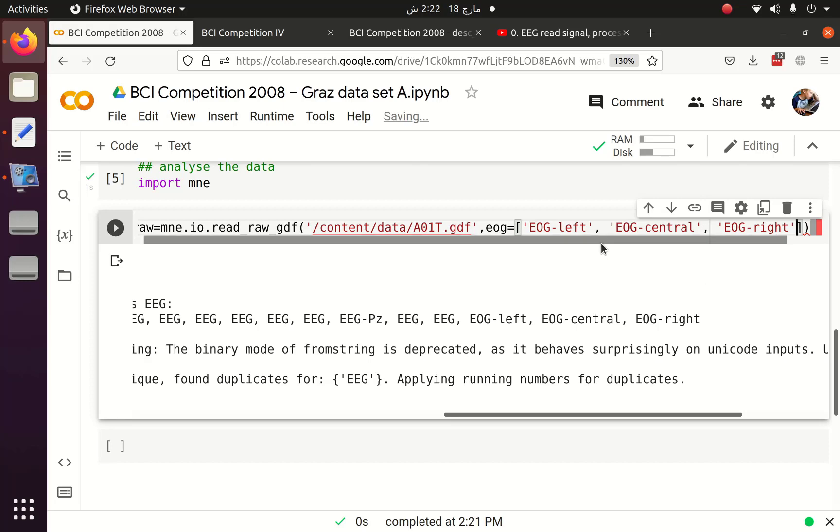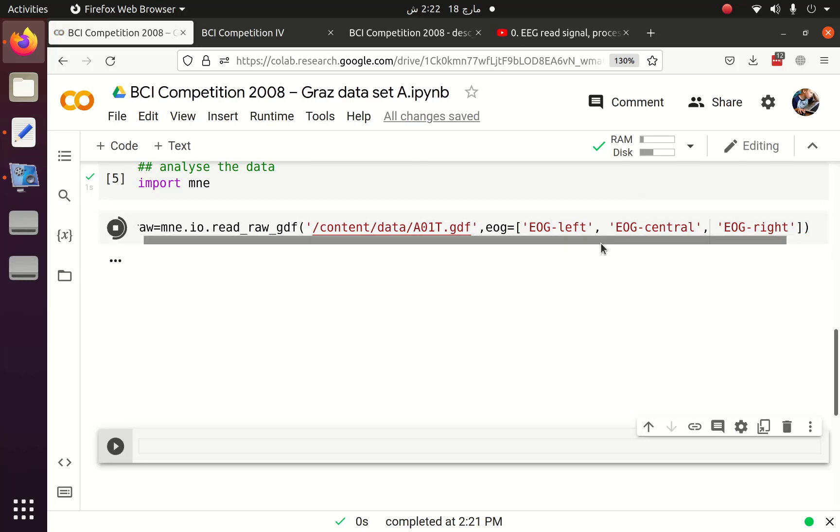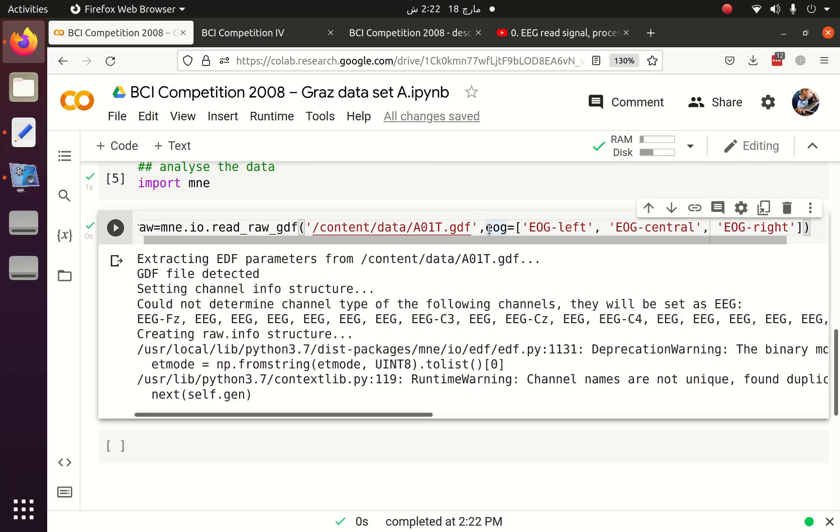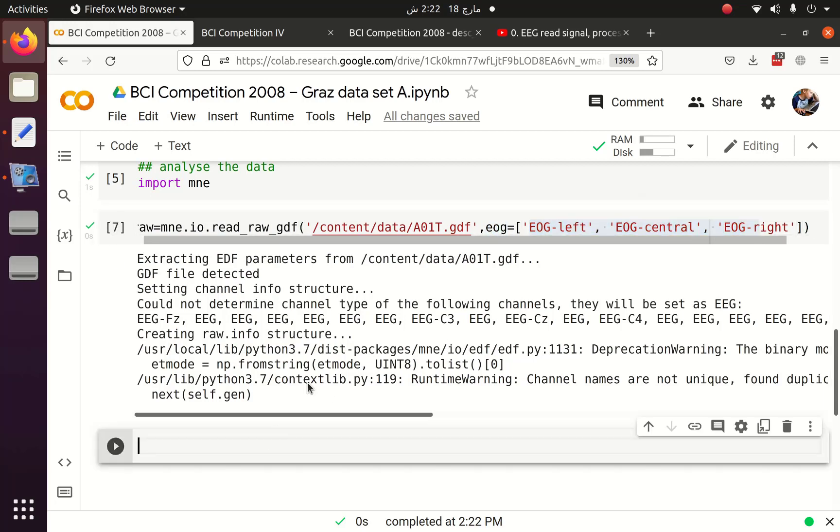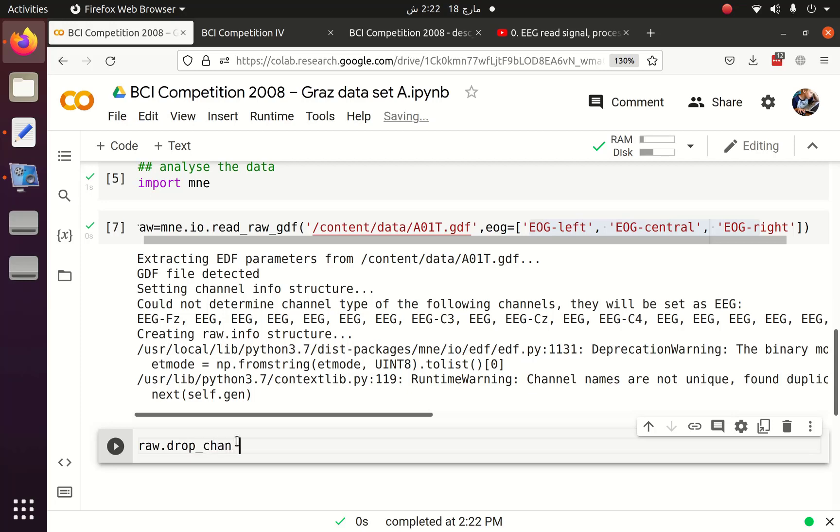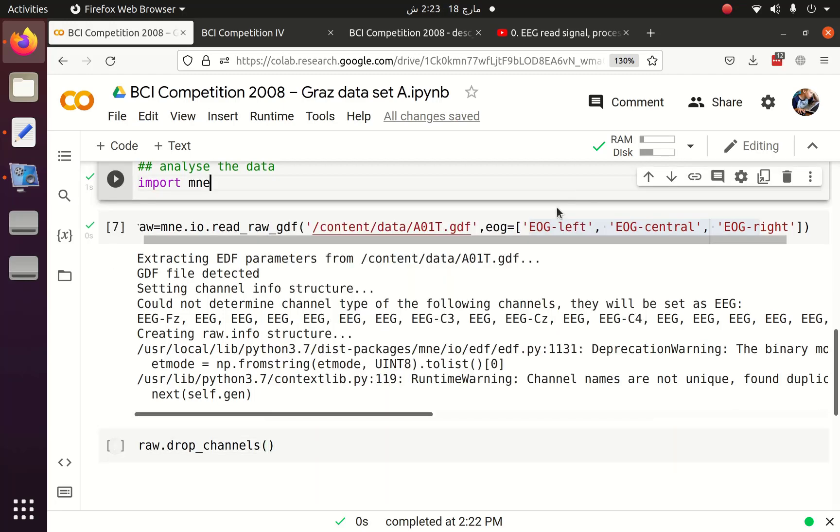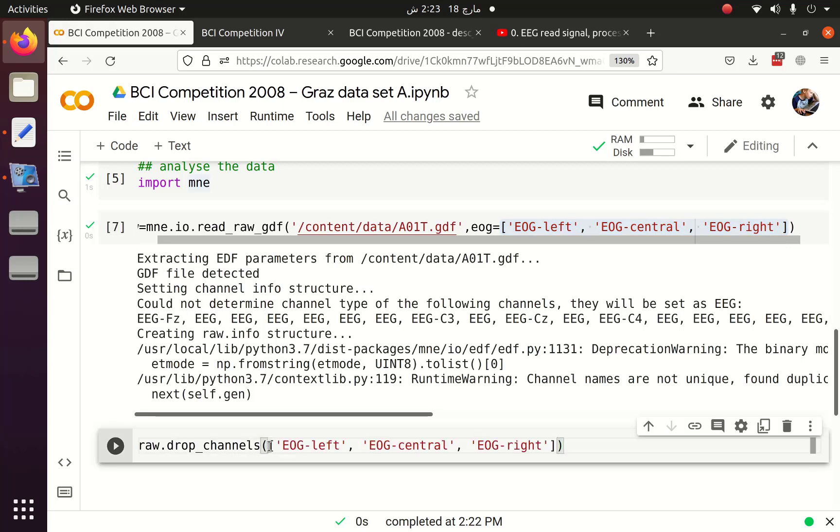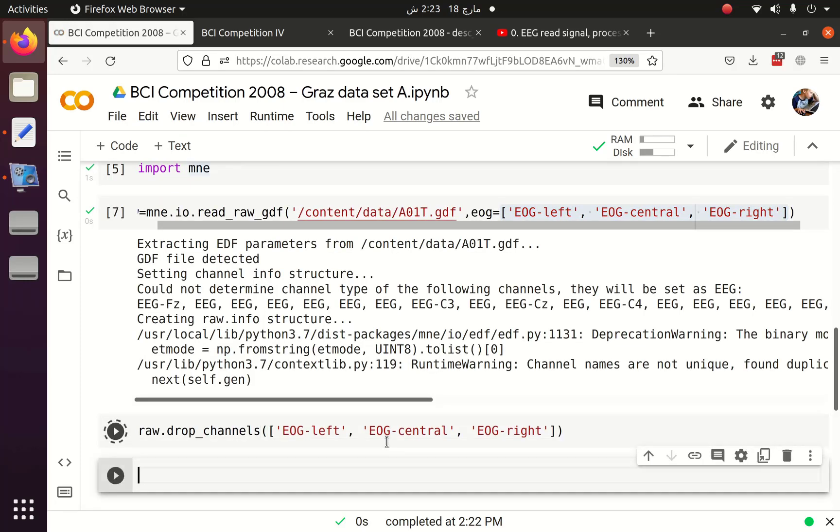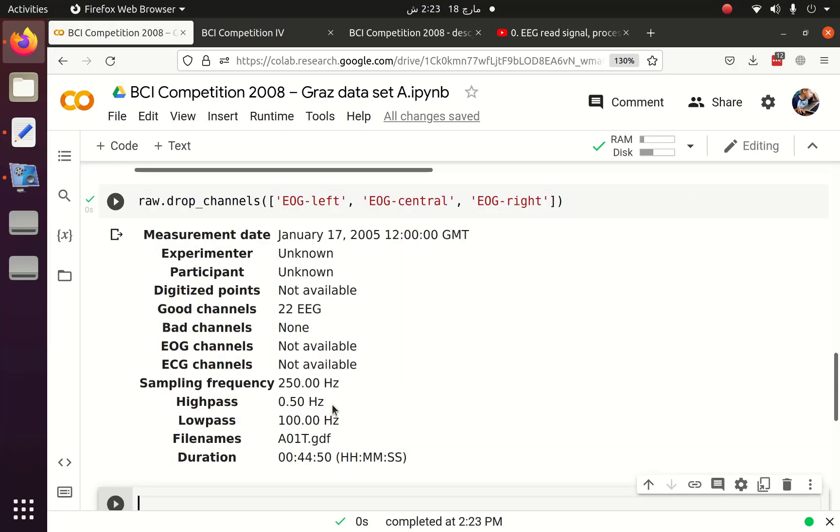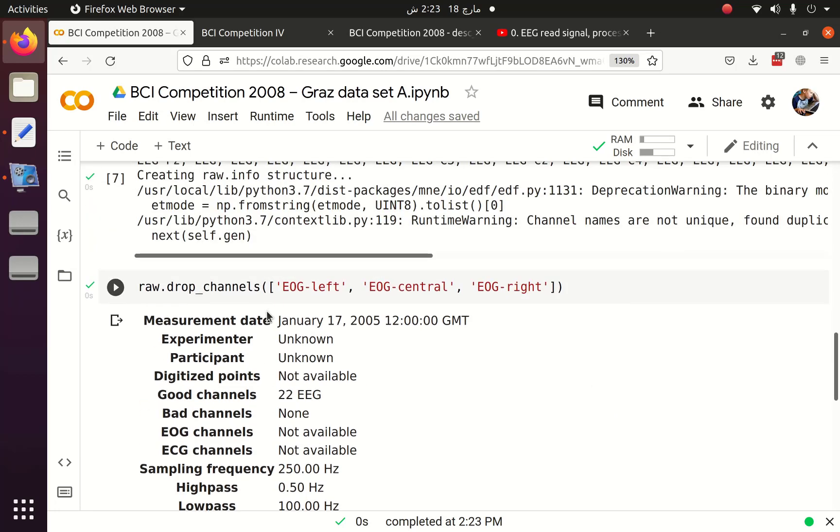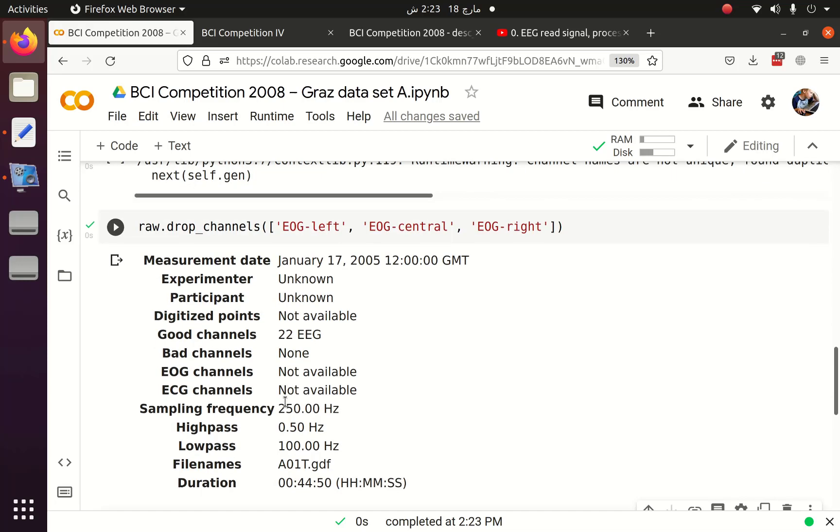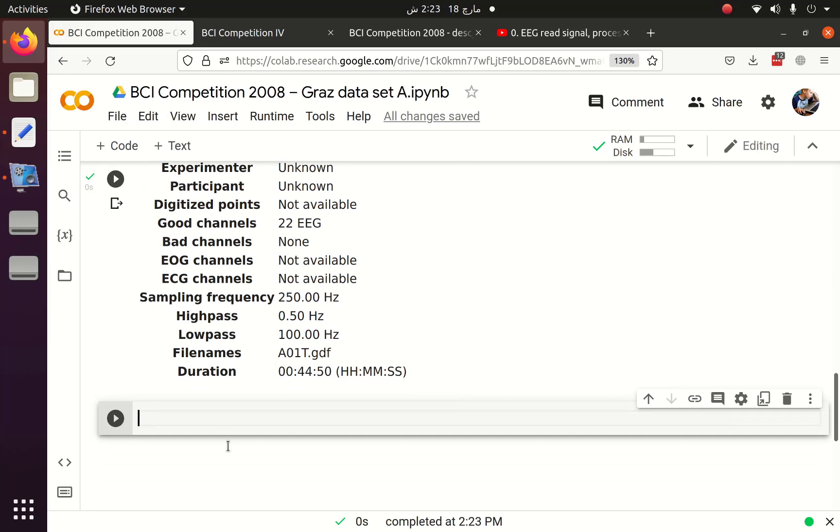So I am going to use any EOG channel. Now I am going to run it again. If I don't define this EOG channel, then these channels are also defined as EEG channels. Now we are not going to use any EOG channels. We only have to use only the EEG channels which are 22, so I am going to drop these EOG channels. Now the number of channels left are 22, which previously were 25. Once we get rid of this channel, we need to extract the annotations which are actually the event information from this dataset or from this file. So I am going to get events.